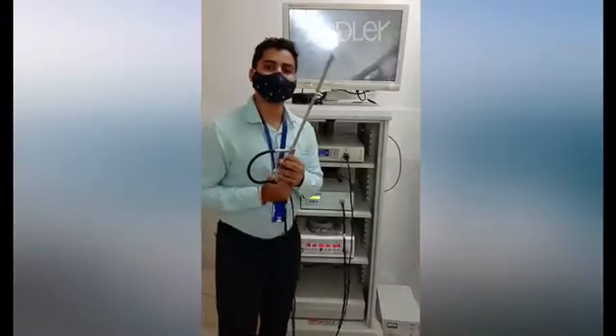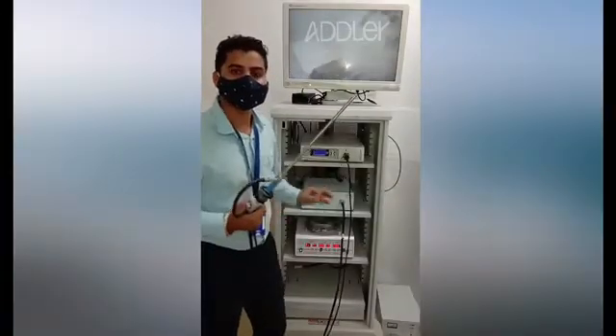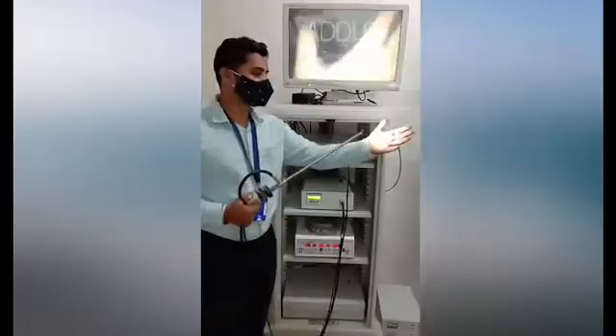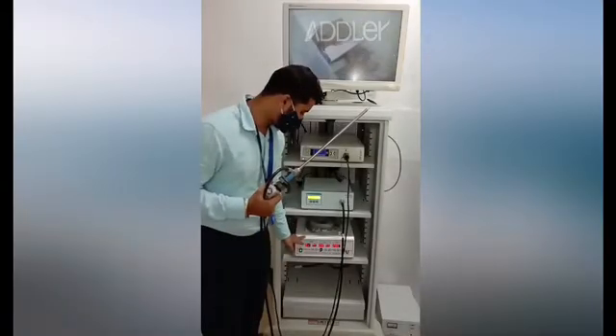I'm using a Stryker 10mm 30-degree scope. This is the LLS 180 light source by Adler, a high intensity light source with more durability compared to other popular light sources. The light is warm and also not very reflective.